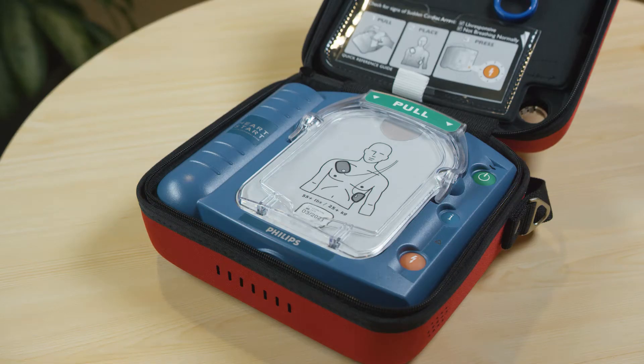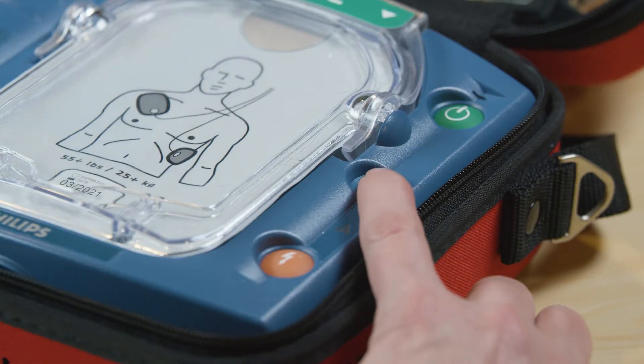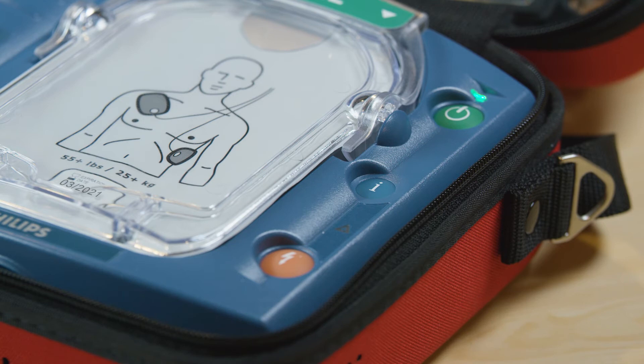Replace your pads when they reach their expiration date. Replace your battery when your device alerts you to: "Low battery. Insert fresh battery."